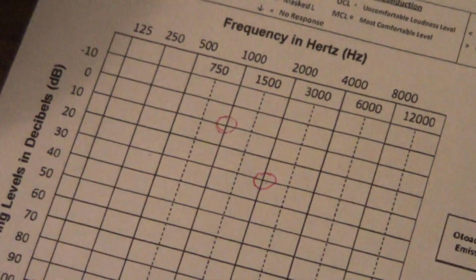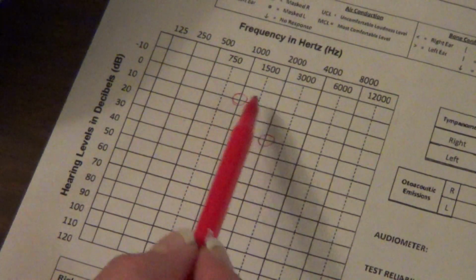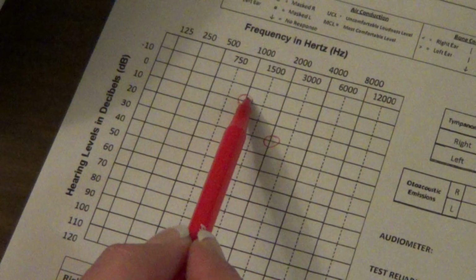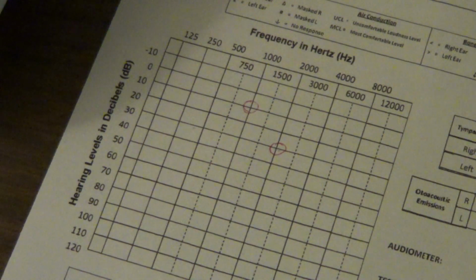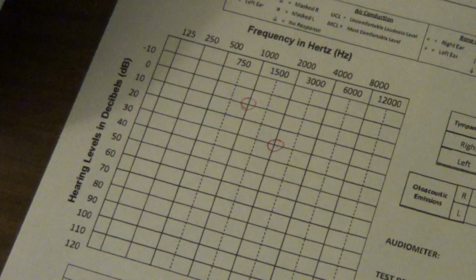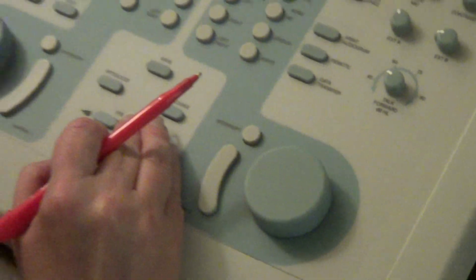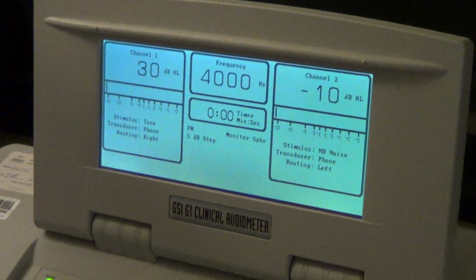Okay. Now, as you can see, there is a difference of 20 decibels between 1000 and 2000 hertz. So in this case, if we were doing this, we'd want to do the interoctave frequency. Okay, let's do one more. Let's go to 4000 hertz at 30.